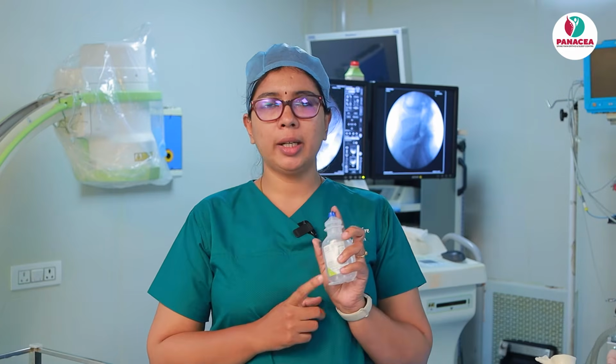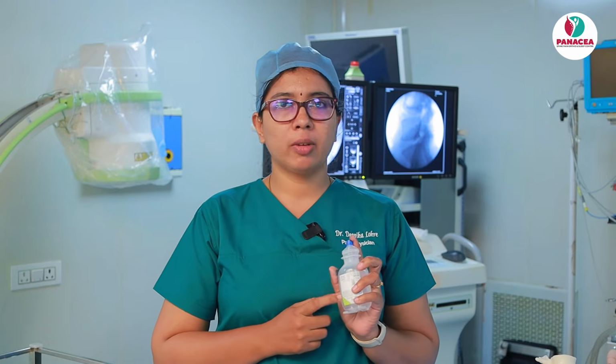So inflammatory mediators, because of the disc herniation, the nucleus pulposus is a foreign material to the body. So it will cause an immune response, which will cause inflammatory mediators to come to the site. Usually 10 ml we will take in a 10 ml syringe and we will give it before giving the drug.